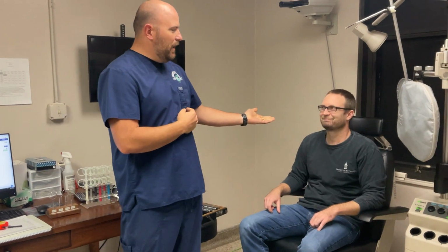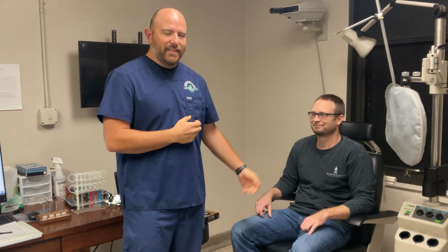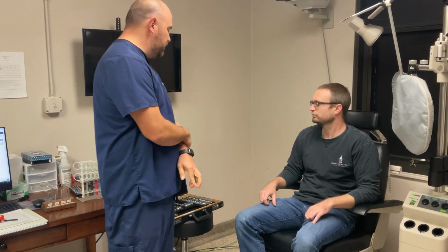Alright, so this is going to be a video tutorial over how to do a low vision refraction. We have with us here our patient, we'll call him Mr. Smith, and we're going to conduct a low vision refraction on him. As part of the low vision refraction, we are giving the students the retinoscopy findings, and we're also giving the students their visual acuities.